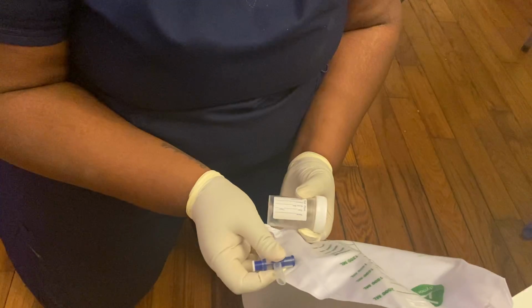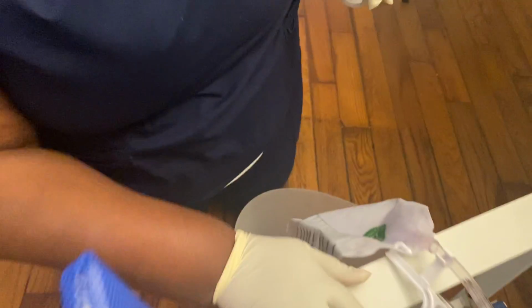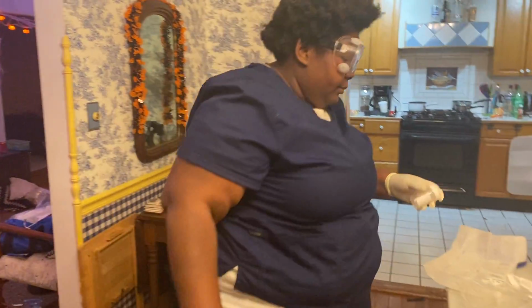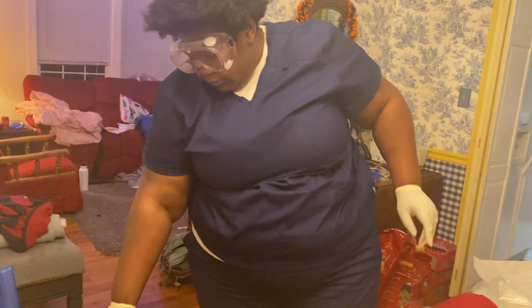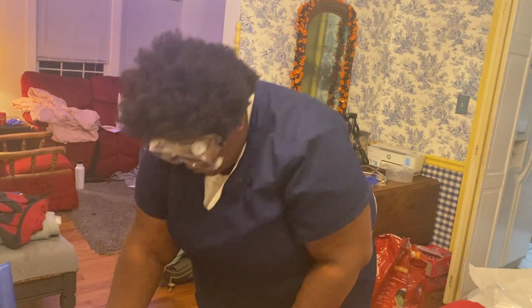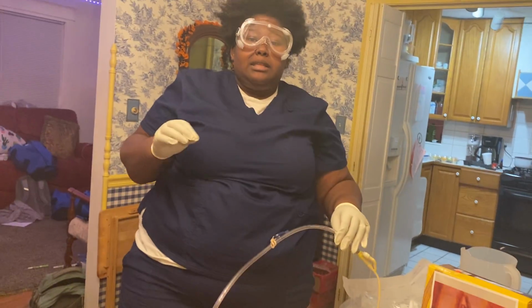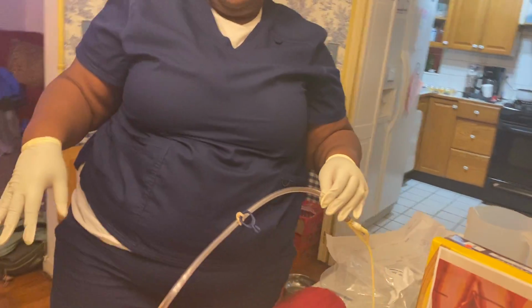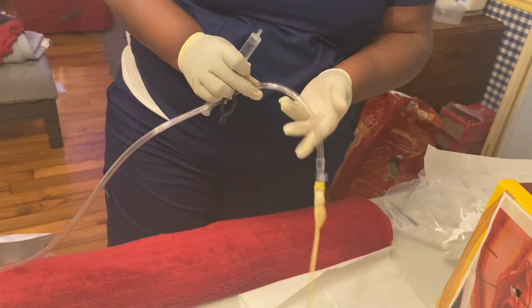And I'm going to place it back. I would like to note I broke sterility trying to get up and down from there. With the tube, this would happen when I collect a specimen from a new catheter. But if it was an old catheter, I will get the syringe.